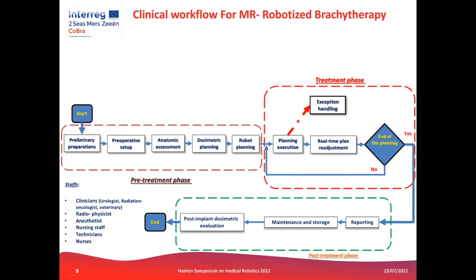From the image processing developed by the clinician, the dose calculation is done. The dose calculation and planning allow us to identify the distribution of the dose through the images. This should be done online, and in this pre-treatment phase we want, through this project, to reduce or minimize the calculation significantly, in order to allow the robot to plan its trajectory automatically.